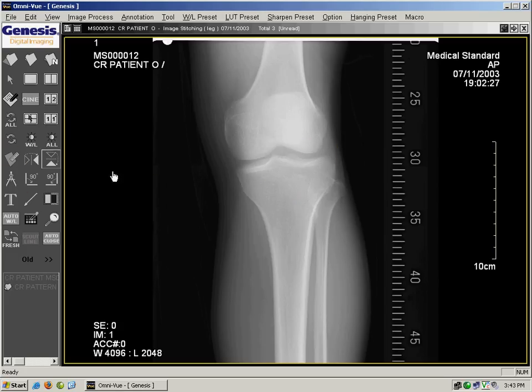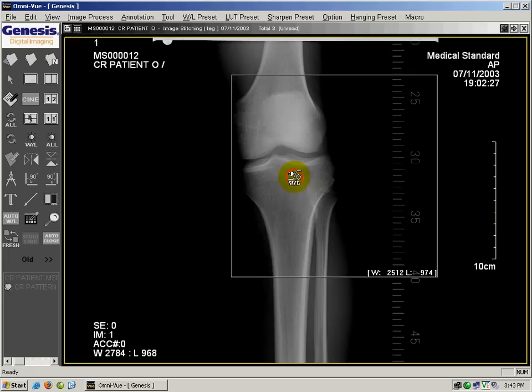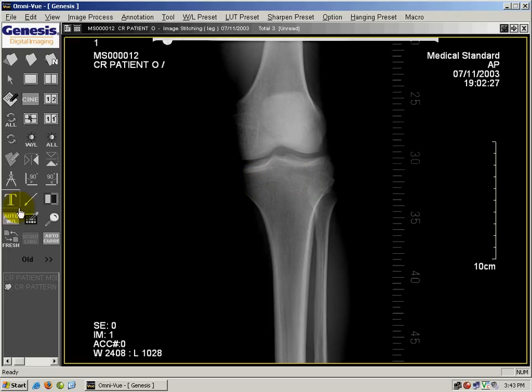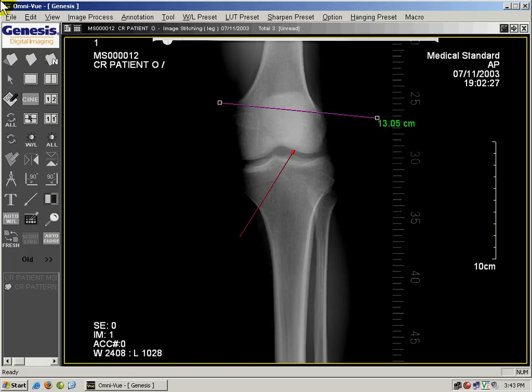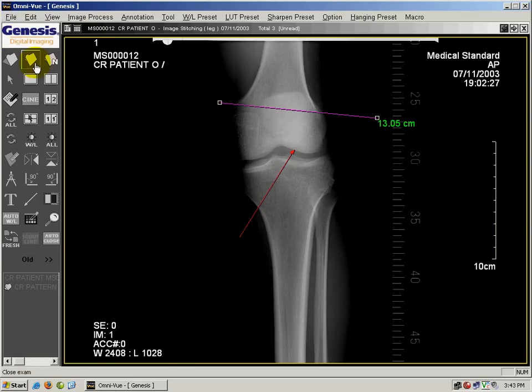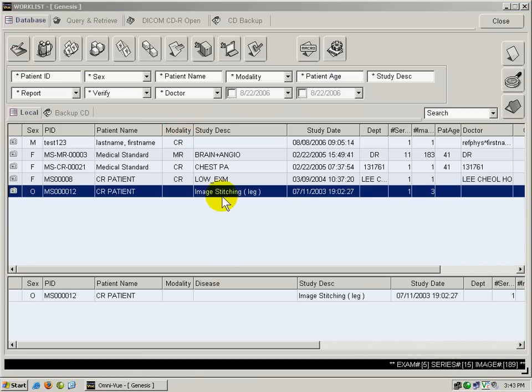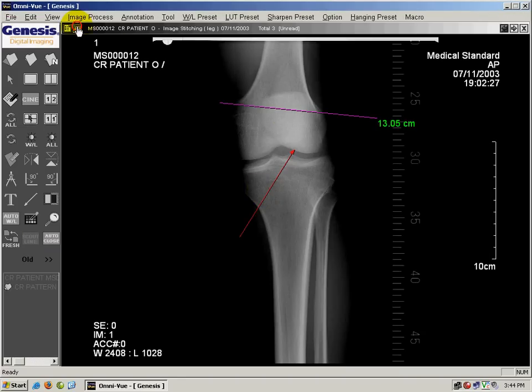When we're done viewing an image and we've window leveled it to our liking and want to save the changes we've made, including annotations, we're going to click File and Save. Now I'm going to close this exam and go back to the work list, and when I go back to this study it'll have those changes saved to it. I'm going to double click on it to open the exam again — and here I have the modified image.